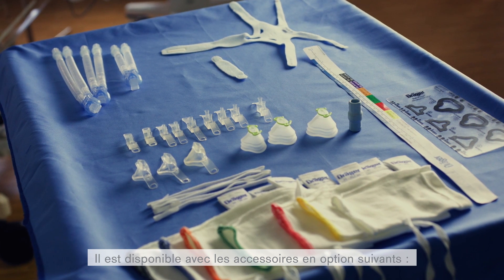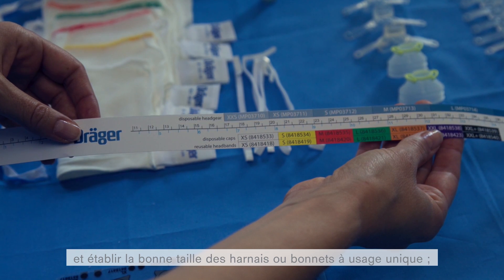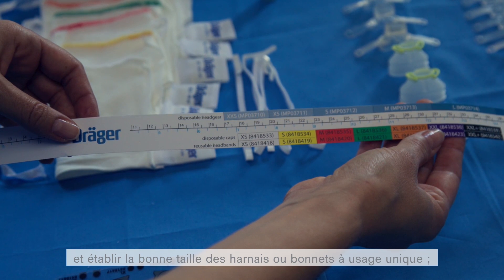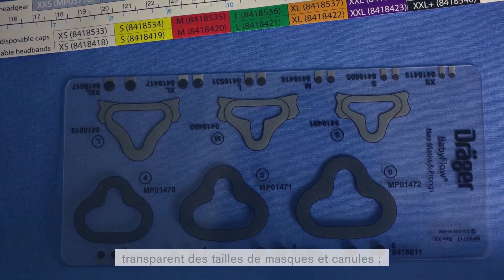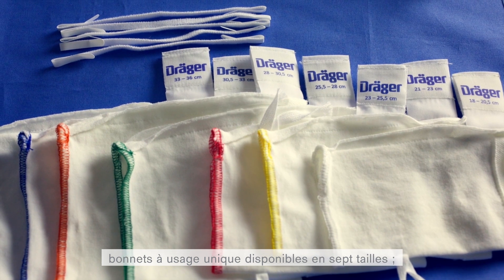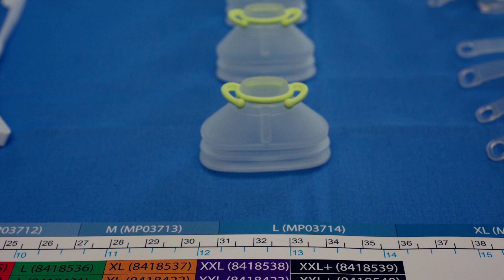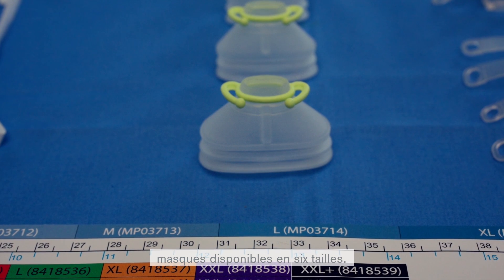It is available with the following accessory options: a measurement tape to measure the infant's head and determine the appropriate size of headgear or disposable caps; a sizing card for mask and prongs; headgear available in six sizes; disposable caps available in eight sizes; prongs available in eleven sizes; and mask available in six sizes.